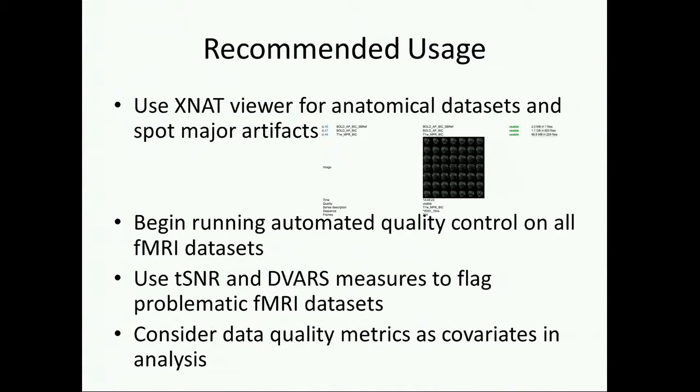So that is available right now for people to use. And if you take away nothing else from this talk, and if you're not immediately able to use some sort of Nifty viewer or processing viewer, start using at least the XNAT interface as soon as you've acquired the data. You can actually use the XNAT viewer to view the data without downloading any software.